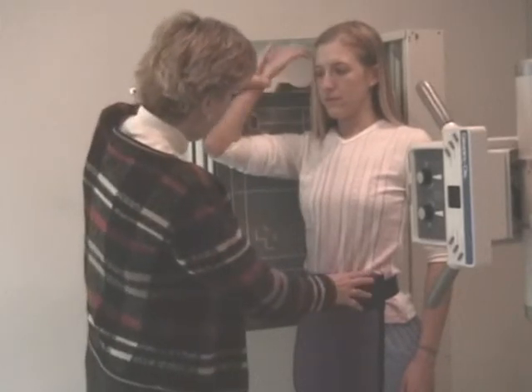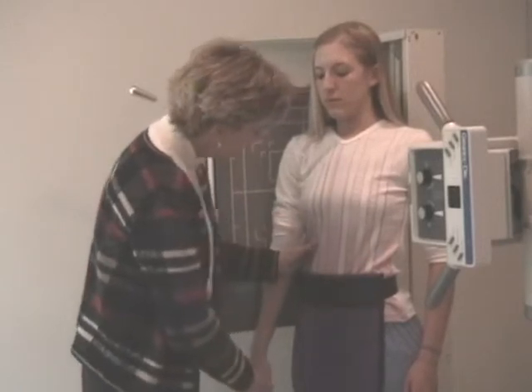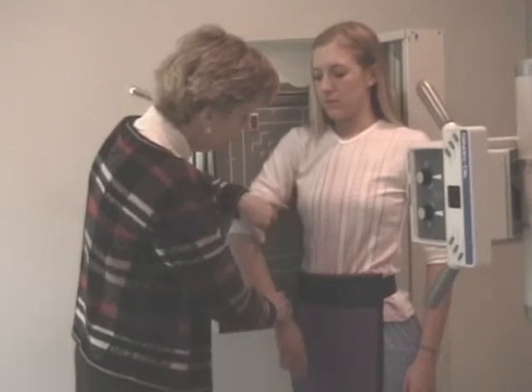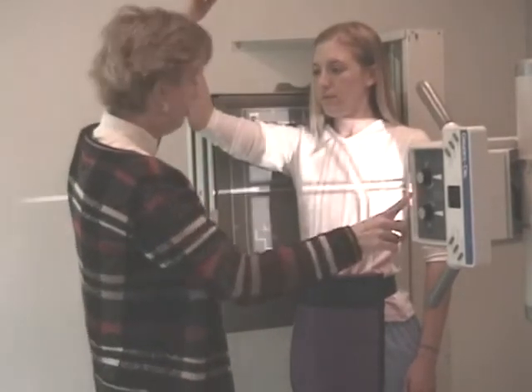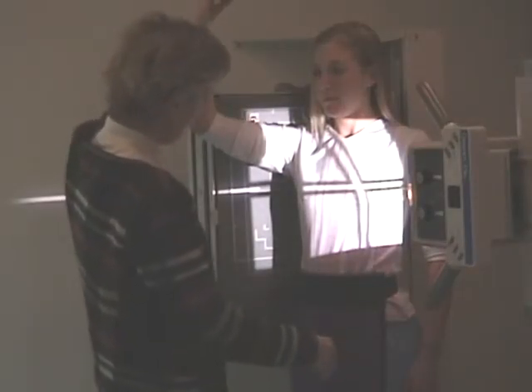Now this arm, if it was down, the tissue would end up getting into the rib. So we need to bring the arm out a ways. There's many ways you can do that. You can do it like this, or you could give them a pole to hold on to, if you've got a pole readily available.